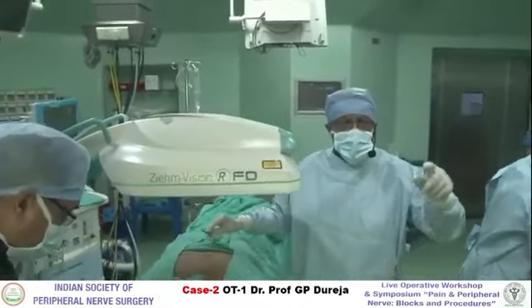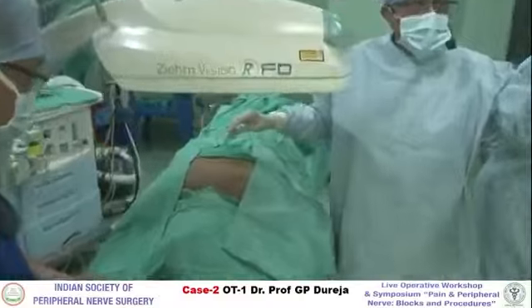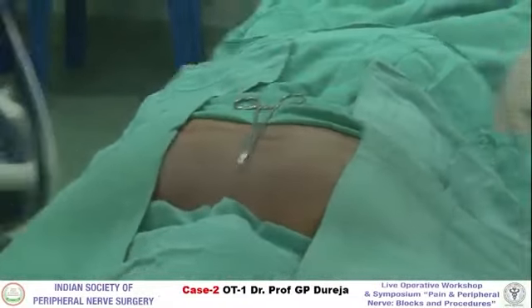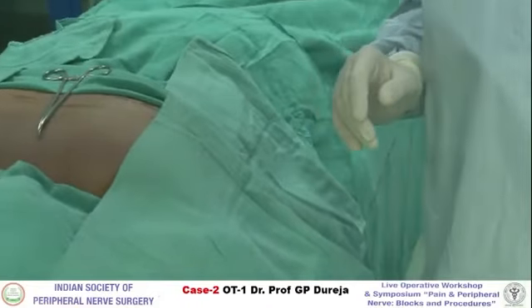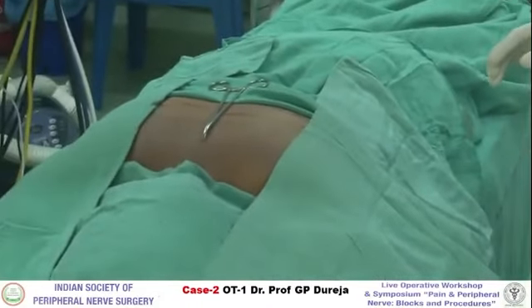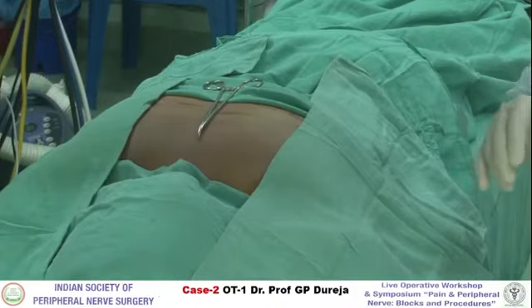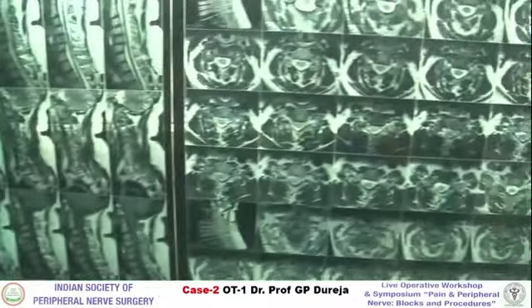Camera on the MRI, please. Yes, Abhishek, we are there with you. Okay, fine. So we just have a look at the MRI imaging. Anybody can show the MRI? Yes, this is cervical.